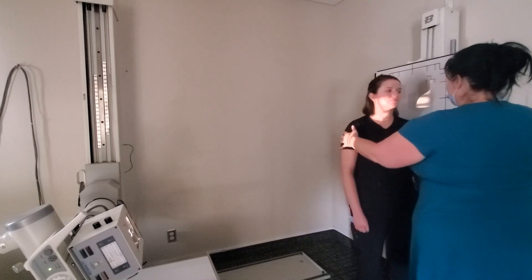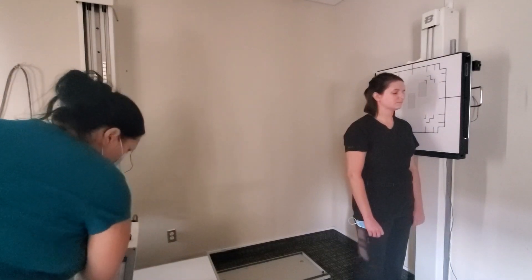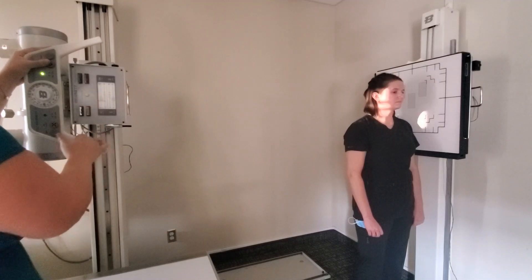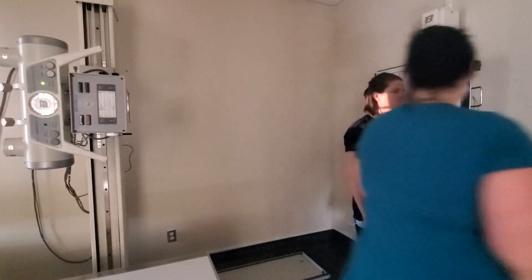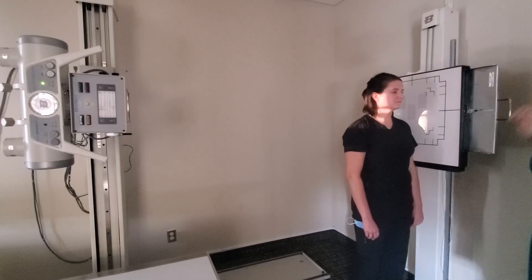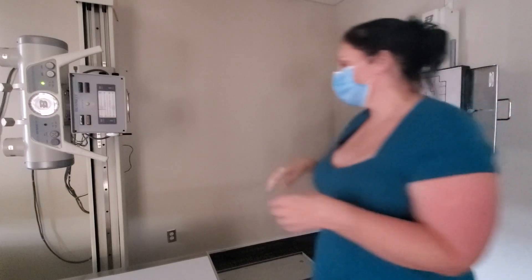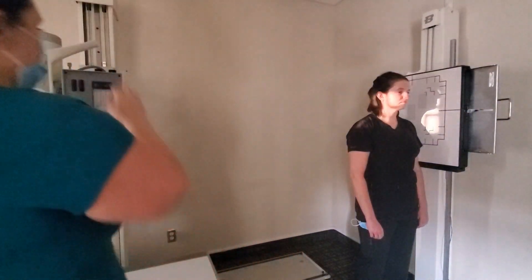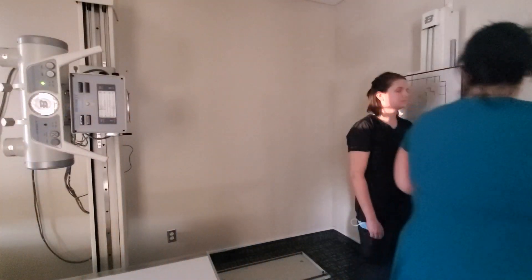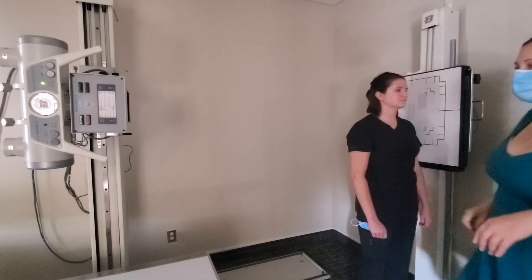For the lateral C-spine, rotate your patient to true 90 degrees — this utilizes a perpendicular beam. The idea is to have sandbags affixed to the wrists so that the shoulders get pulled down more effectively, because the thickness of the humeral heads makes it difficult to see the C7-T1 area. Align your tube and bucky, get the patient in a true lateral, and use sandbags when available in the real world.